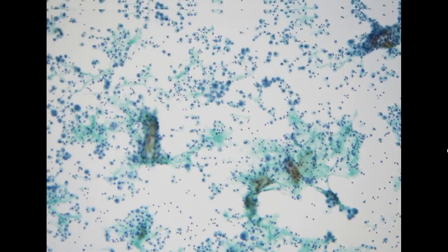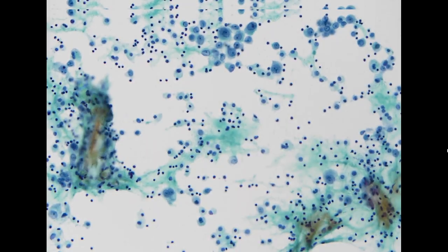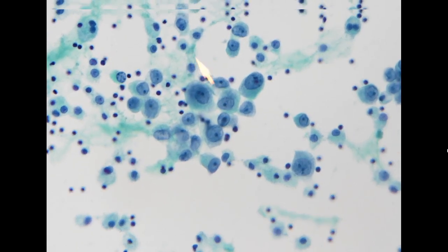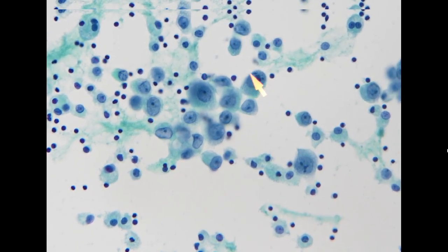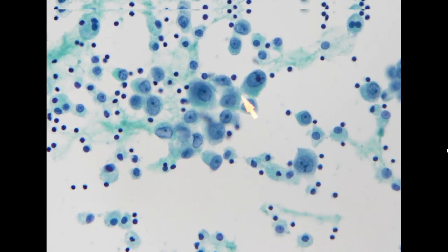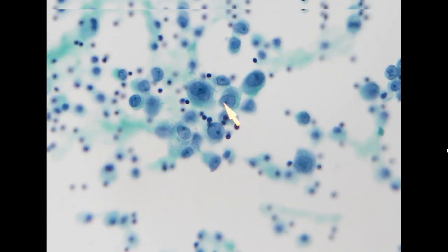Again, pleural effusion, lung cancer. Again, the patient has been treated. We only see individual cells with very big nuclei, prominent nucleoli, and eccentric location.